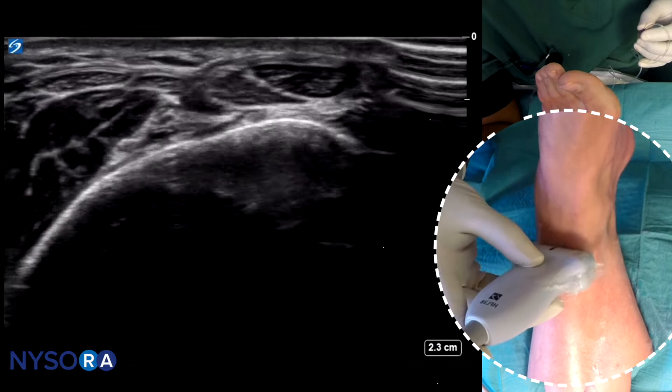This completes the target-specific ankle block for osteotomies — highly valuable for surgery involving osteotomies of the second and third toes.